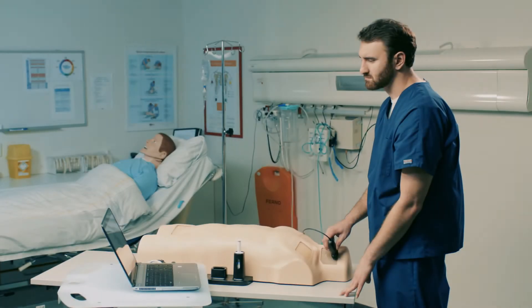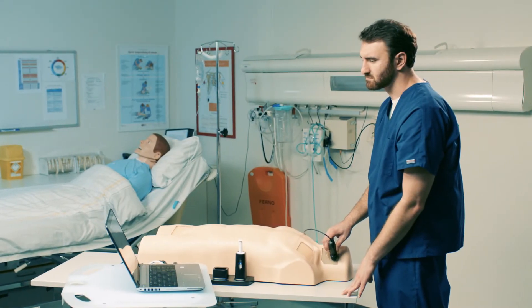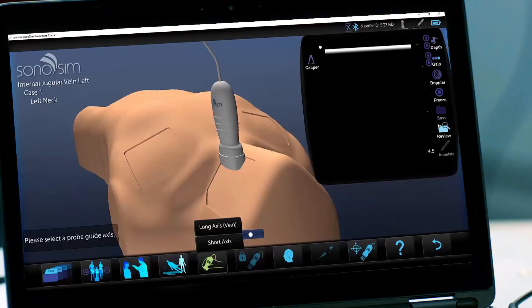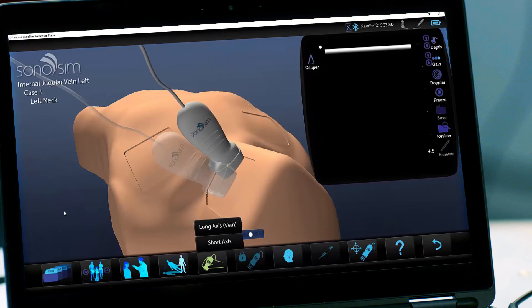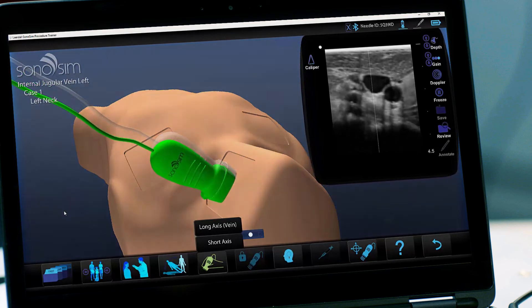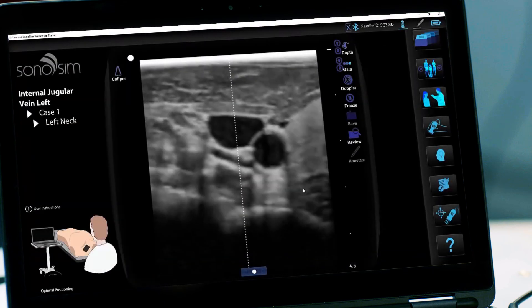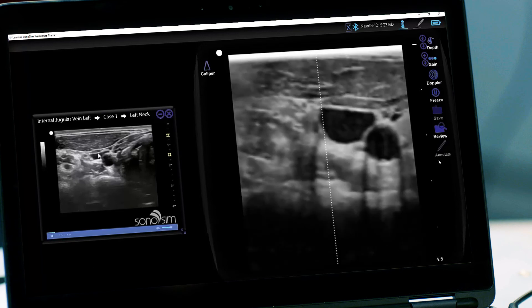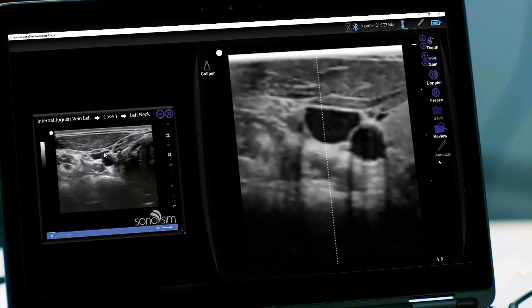If you need help orienting your probe over the target vessel, you can access the Probe Guide screen by selecting the Probe Guide button and selecting either the Long or Short Axis Expert Probe Guide. A virtual torso will show you how to position your probe to obtain the optimal view of the region of interest. You can also select the Findings button to review a narrated version of the ultrasound scan. The video points out important structures and features from the scan.